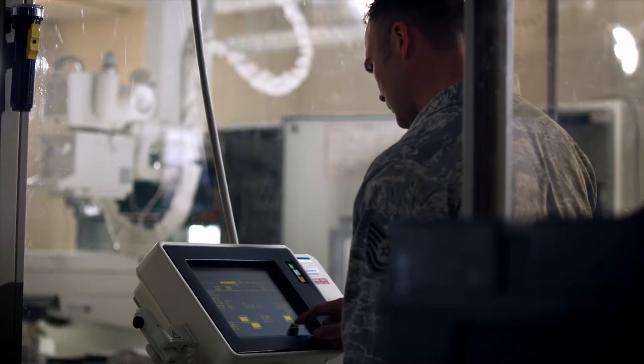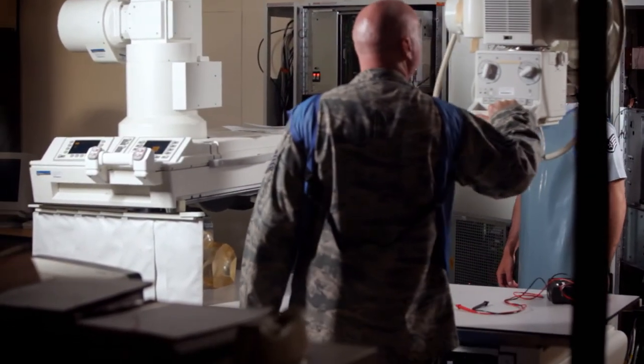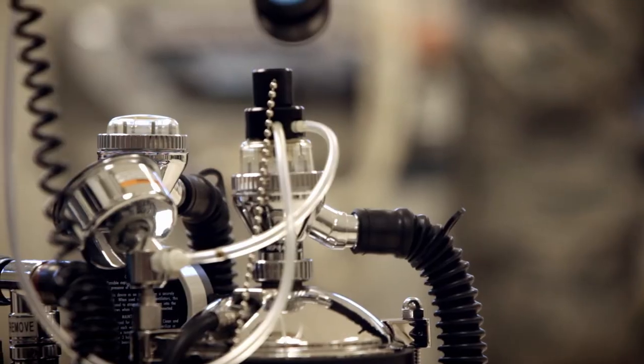Some of the equipment we use is the x-ray machines, the mobile x-ray, the film processor for that. We use defibrillators, infusion pumps.